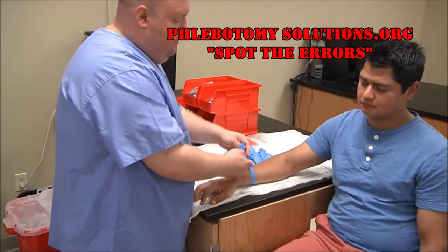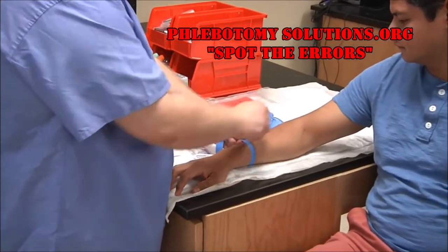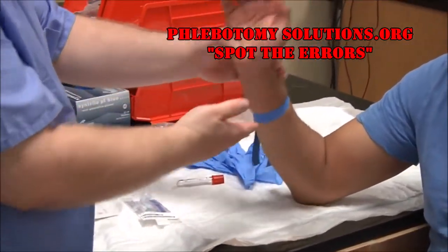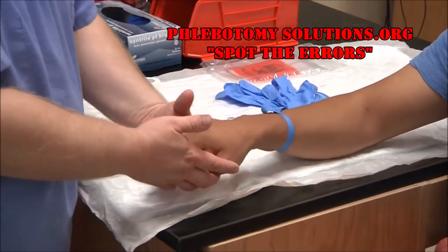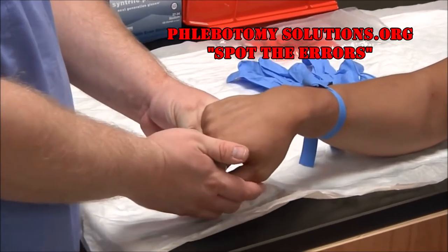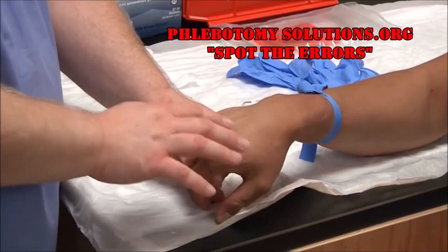Apply your tourniquet about two to four inches from where you plan to draw. Make it snug and be sure not to let it roll in the back — keep it flush. When doing a hand draw with a butterfly, you may need to bend the patient's hand a little bit, and as you can see, it makes the veins more prominent.